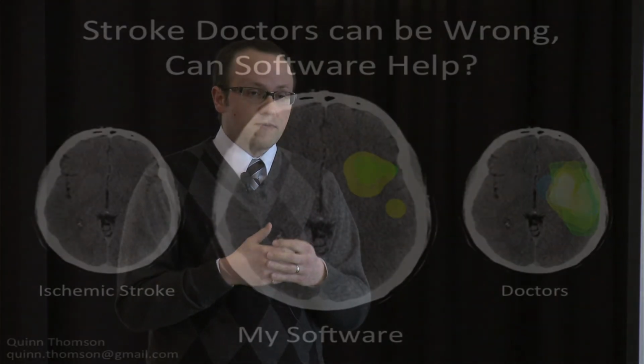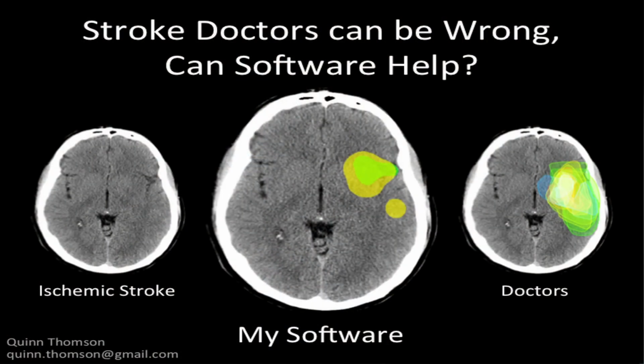And so to do this, I compare the stroke-affected side of the brain to the healthy side of the brain. And I'm looking for two specific things. I'm looking for where the brain matter is becoming darker, and I'm looking for where gray matter is disappearing. And I look across the entire brain to see how much of the brain has been affected by this. And this has been tuned to world-class stroke experts. And as you can see in the image in the middle, this software is working right now. It's fantastic.